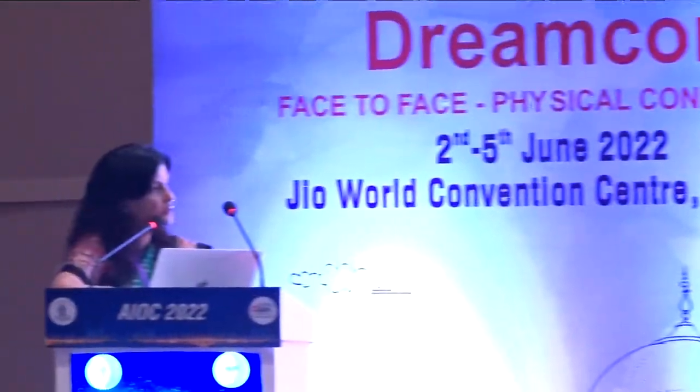Any thoughts on that? So if you're absolutely sure that the regression that has occurred, and there is a residual refractive error of -1 diopter, you're talking about regression, I presume, you can give a try of epithelial debridement and see how it grows. But I'm sure the response would be similar or could be even more exuberant than the first laser that you did. So we've not done any study or any case like that, but like you said, there is a study, it is a useful thought. But to my mind, I don't think it is going to make too much of a difference.